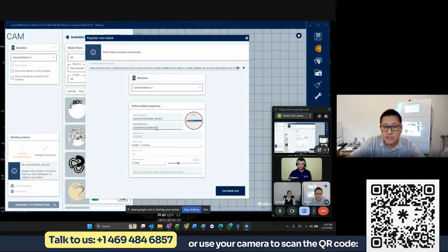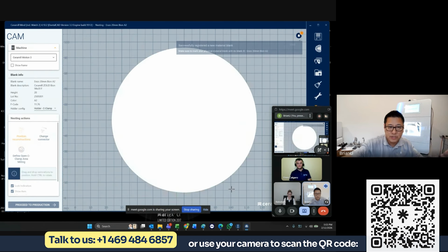All we have to do here is select a name. We just call this Enzo. Enzo, this is a 20 millimeter Bion A2. We have A2 already, but we can still put it right. All right, so easy, quick to register your materials.